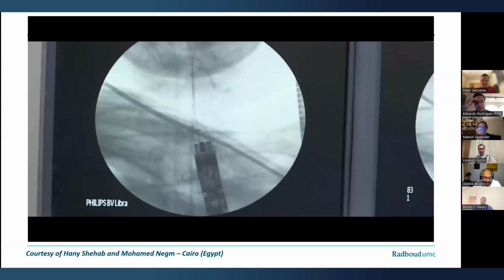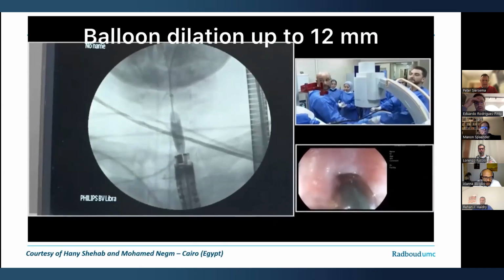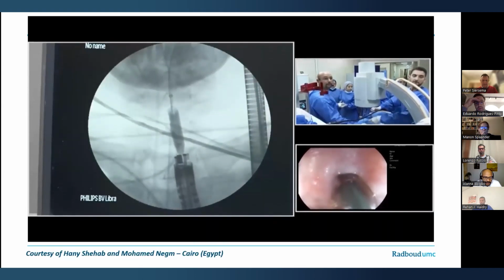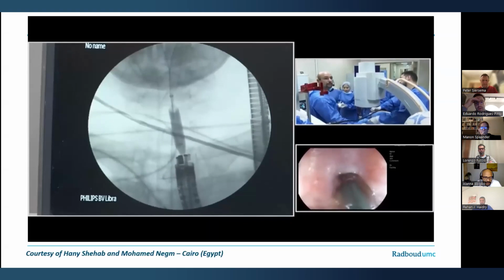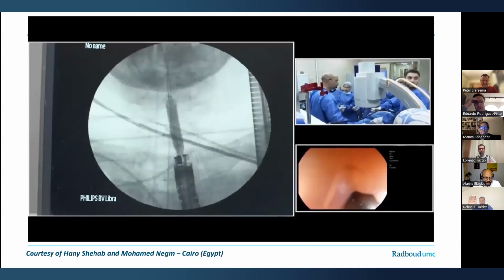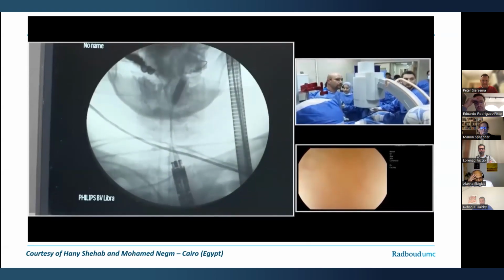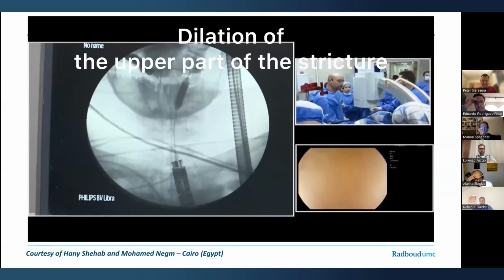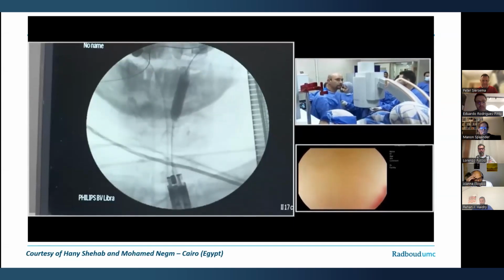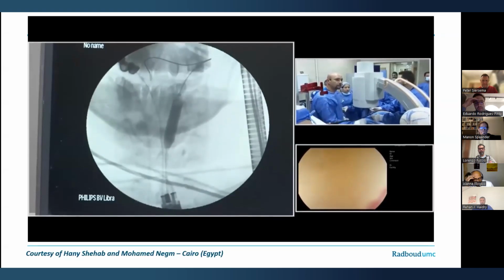Okay, you're back a little bit. Yeah, keep going. Well done, keep going. Yeah, fantastic. Is this maximum? No, not much. So how much are we now? So now we're at the maximum. You want it further down? Just wait. This is the place where we have the balloon to be. Is it too far up?